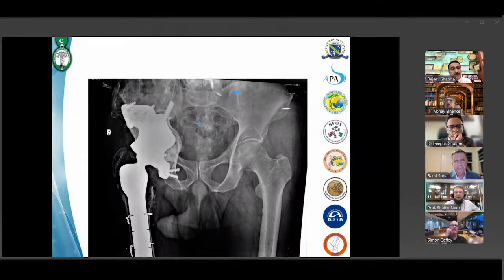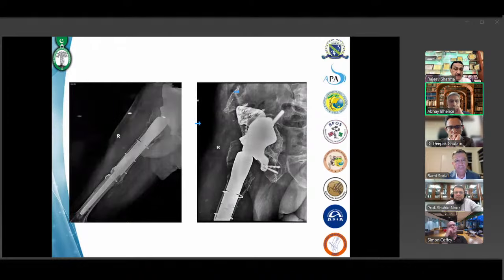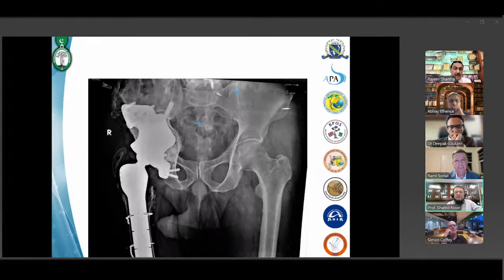We have an ilial wing, which has got a trabecular metal surface. We have an ischial wing, and we have put a dual mobility press fit type of implant. And reconstruction on the femoral side, because of 3B, we've used a proximal femur replacement. This patient is 5 years down the line, and you can see, especially on the medial side, there is biological bone growth. So impaction bone grafting, mechanical fixation, biological restoration, both on the femur and acetabular side, and the patient is pretty happy.